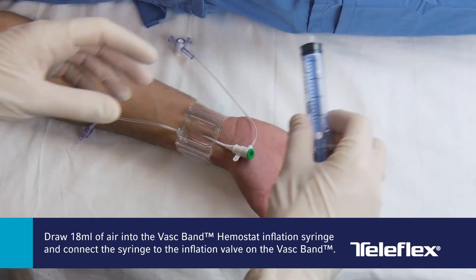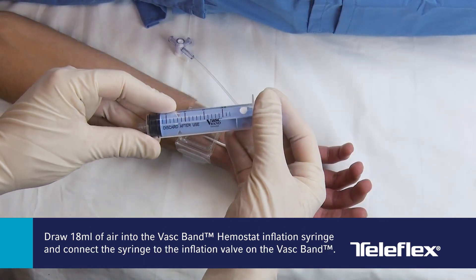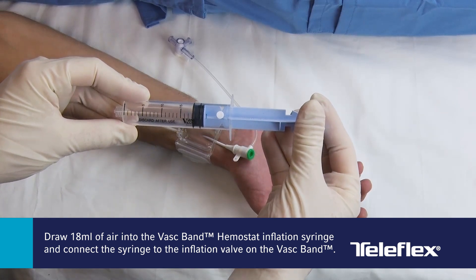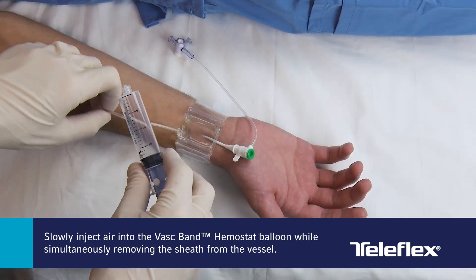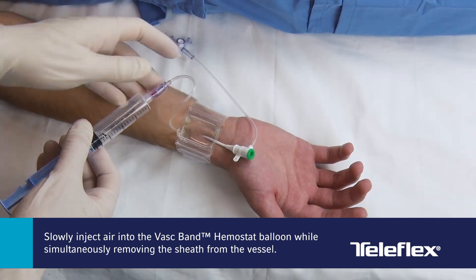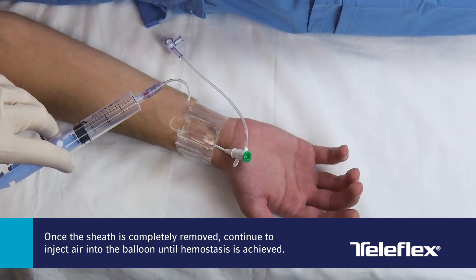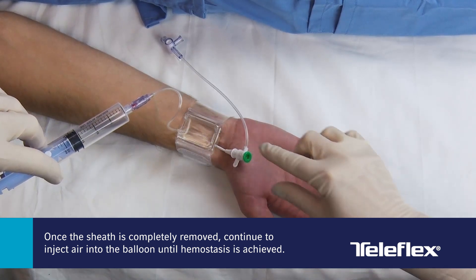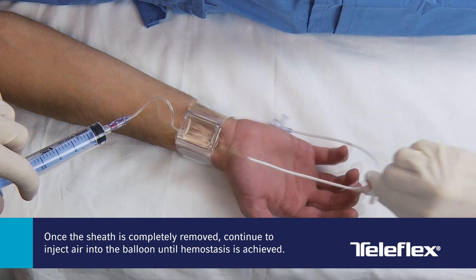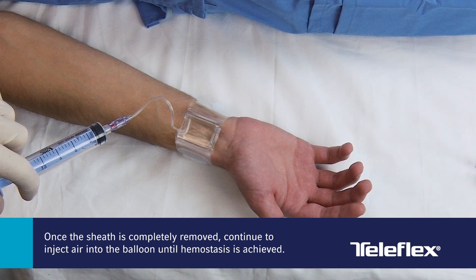Draw 18 mL of air into the VASC-Band inflation syringe and connect the syringe to the inflation valve on the VASC-Band. Slowly inject air into the VASC-Band balloon while simultaneously removing the sheath from the vessel. Once the sheath is completely removed, continue to inject air until hemostasis is achieved. The nominal air injection volume is 15 mL and the maximum is 18 mL.